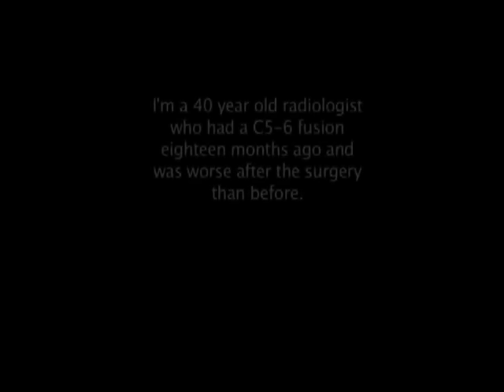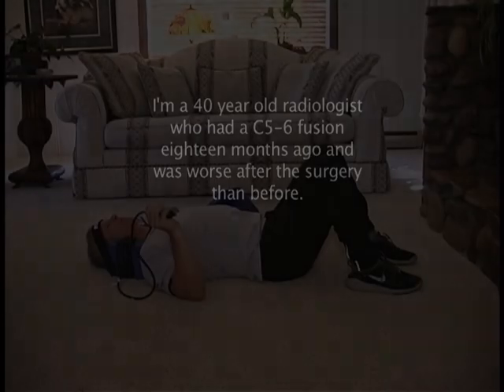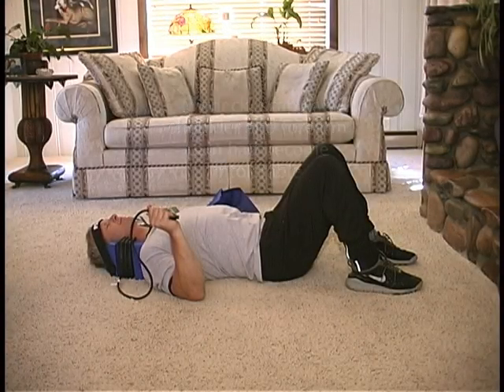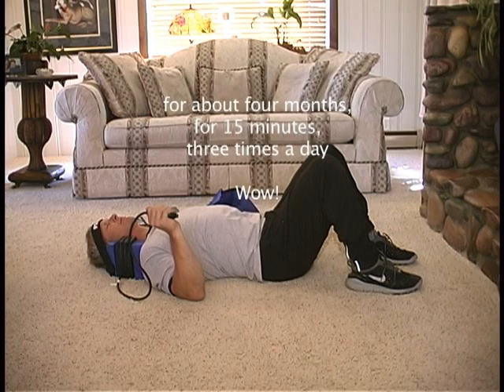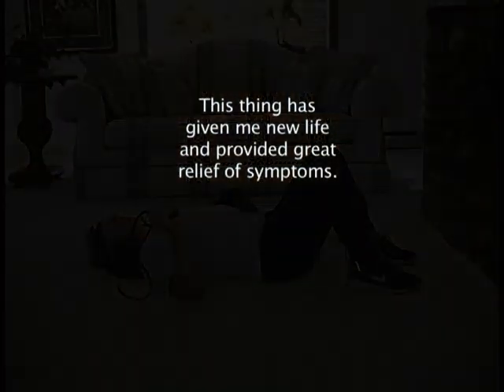The testimonials speak for themselves. An M.D. writes: I'm a 40-year-old radiologist who had a C5-6 fusion 18 months ago and was worse after the surgery than before. My neck, scapular, shoulder, and forearm pain had become intolerable and I had stopped upper body exercising and playing guitar. A desperate internet search led me to try your product, which I had been using religiously for about four months, for 15 minutes, three times a day. Wow! This thing has given me new life and provided great relief of symptoms. Thanks!